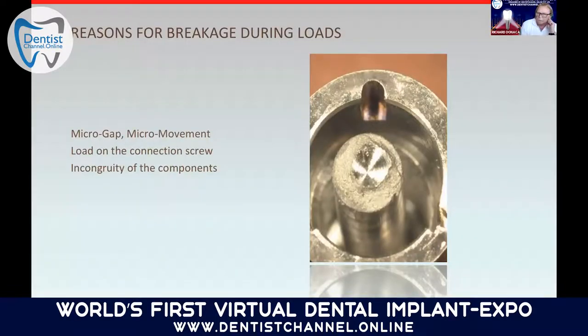A reason for breakages during loads is usually the micro gap, the micro movement. The more play you have, the more strain you're going to put on the connection. The load on the connection screw and the incongruity of the components are some major reasons for breakages during loading.